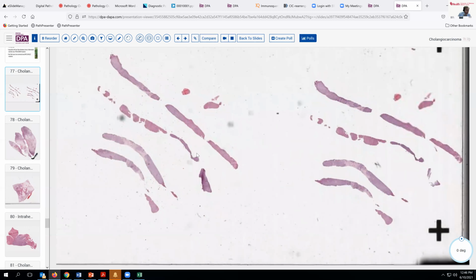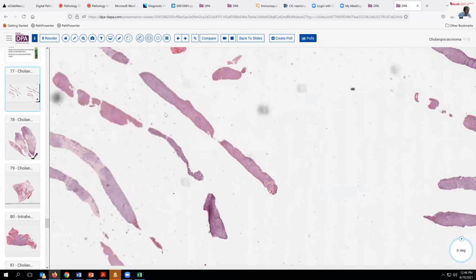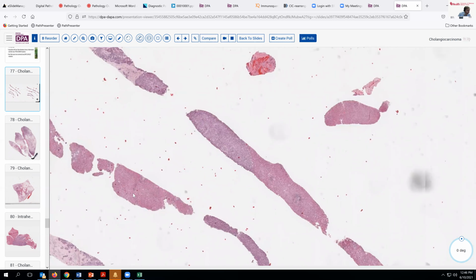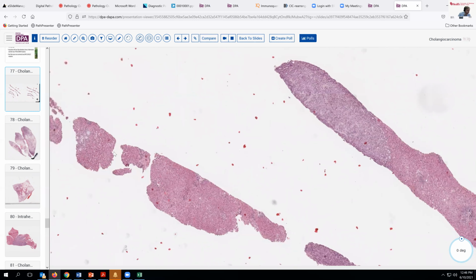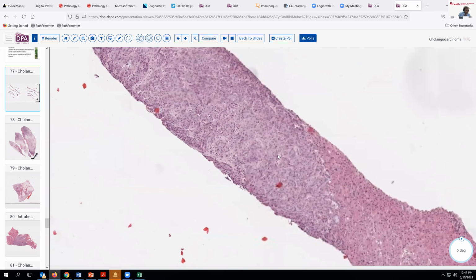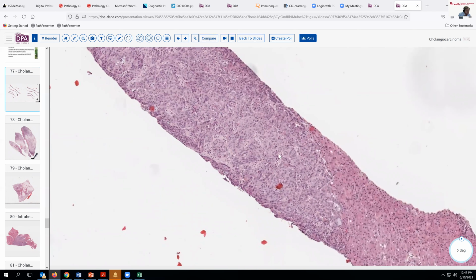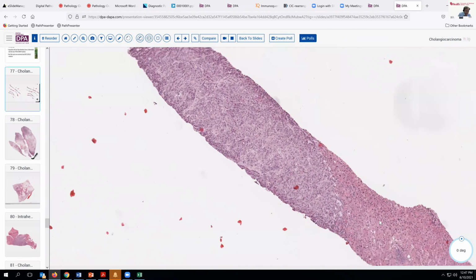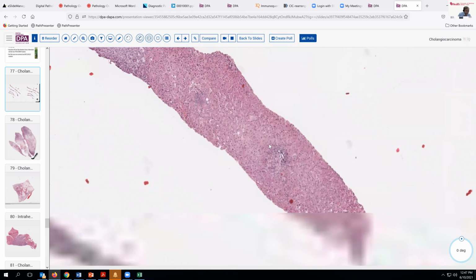So here's an example taken from a liver needle biopsy of what we might see in this kind of a scenario. So here we see some normal liver parenchyma, getting our baseline, some normal bile ducts, and here's our tumor. Now, this does not have the sclerotic collagenized background. This is a more nested pattern with big plump cells, almost solid. So this might look almost more like metastatic breast cancer than cholangiocarcinoma as a first-time diagnosis.